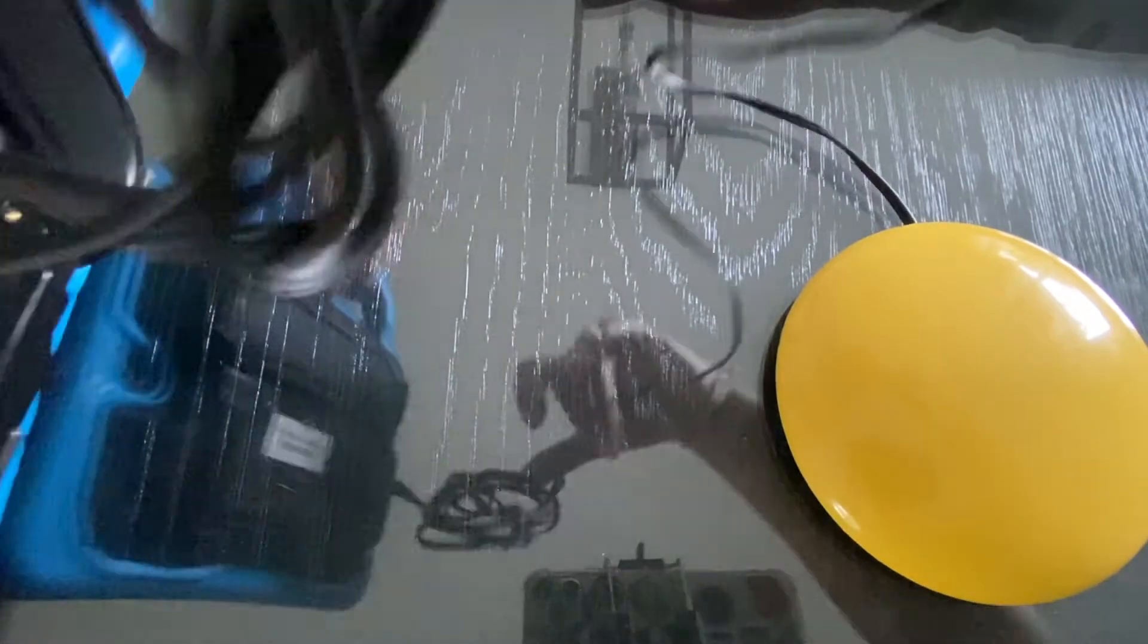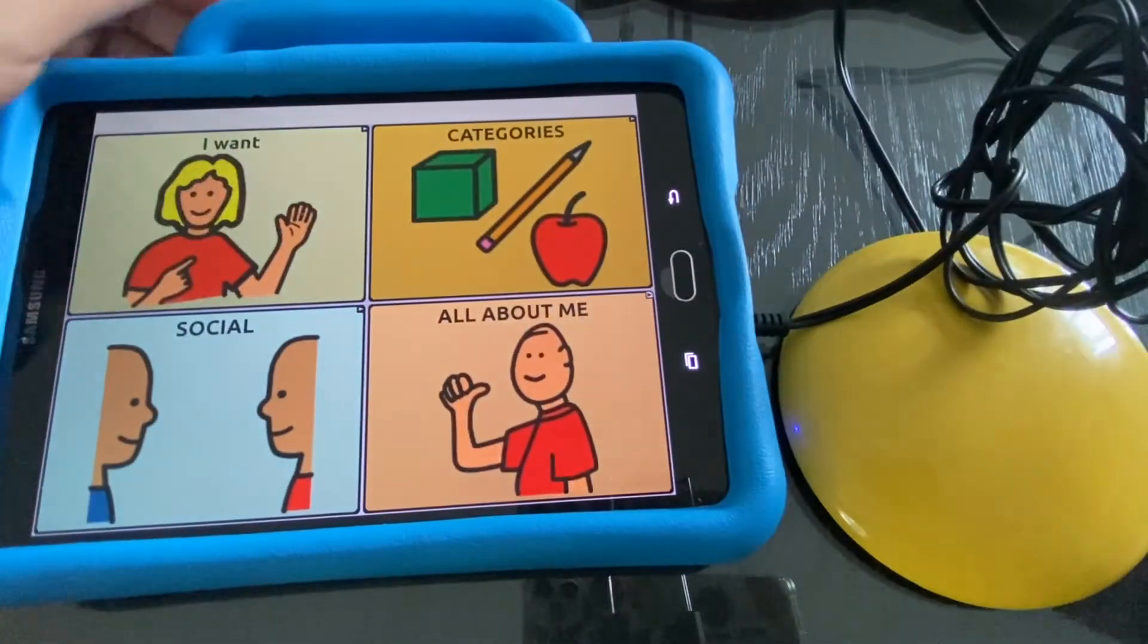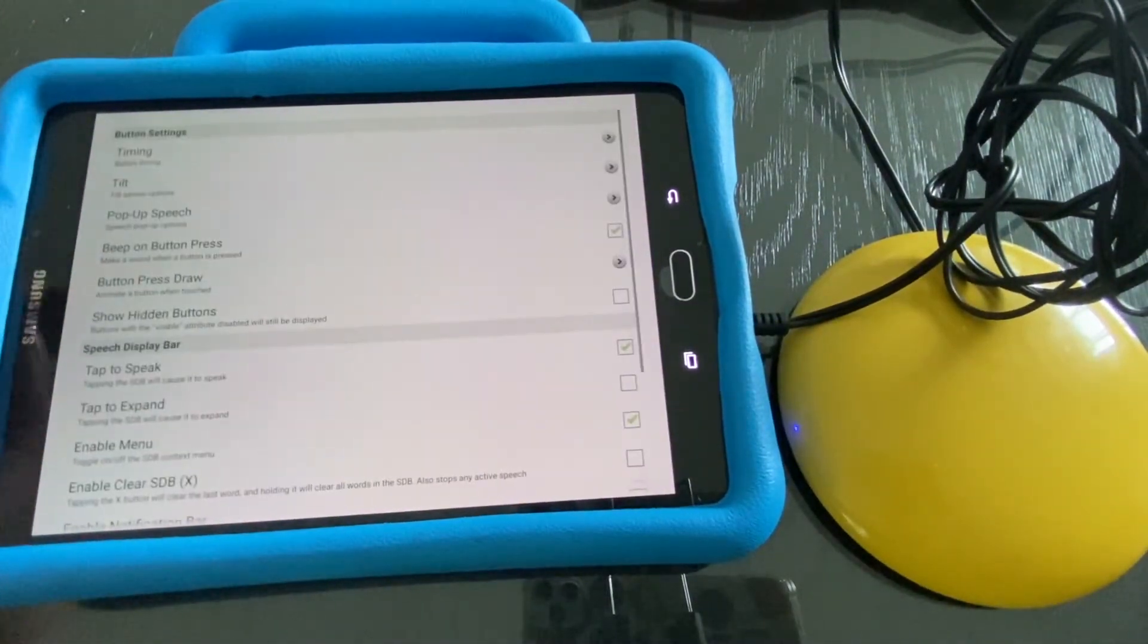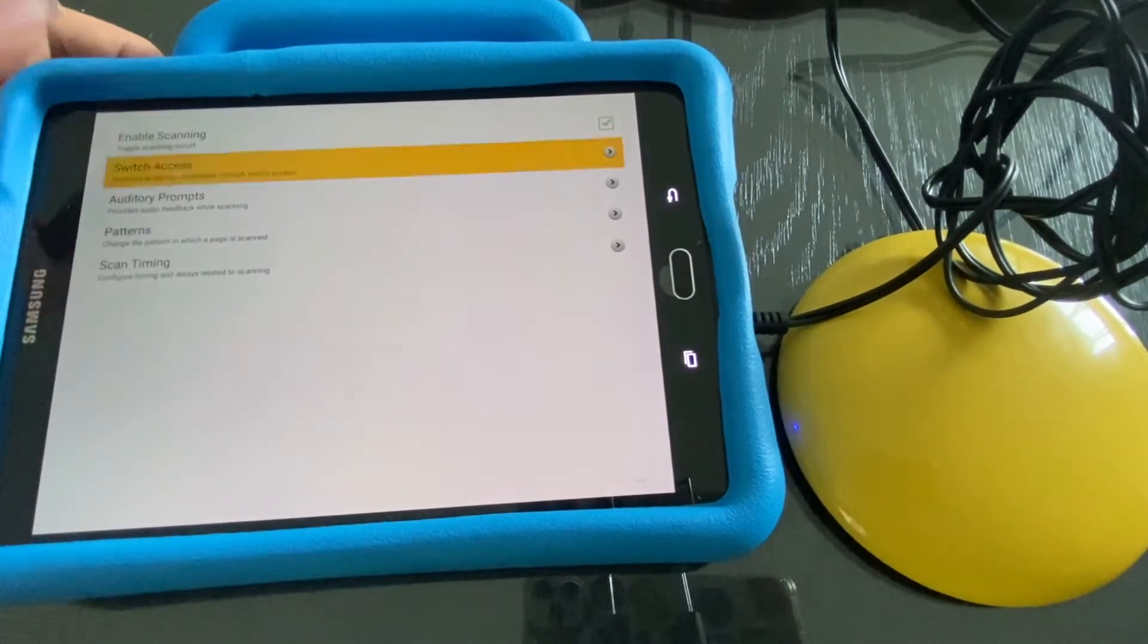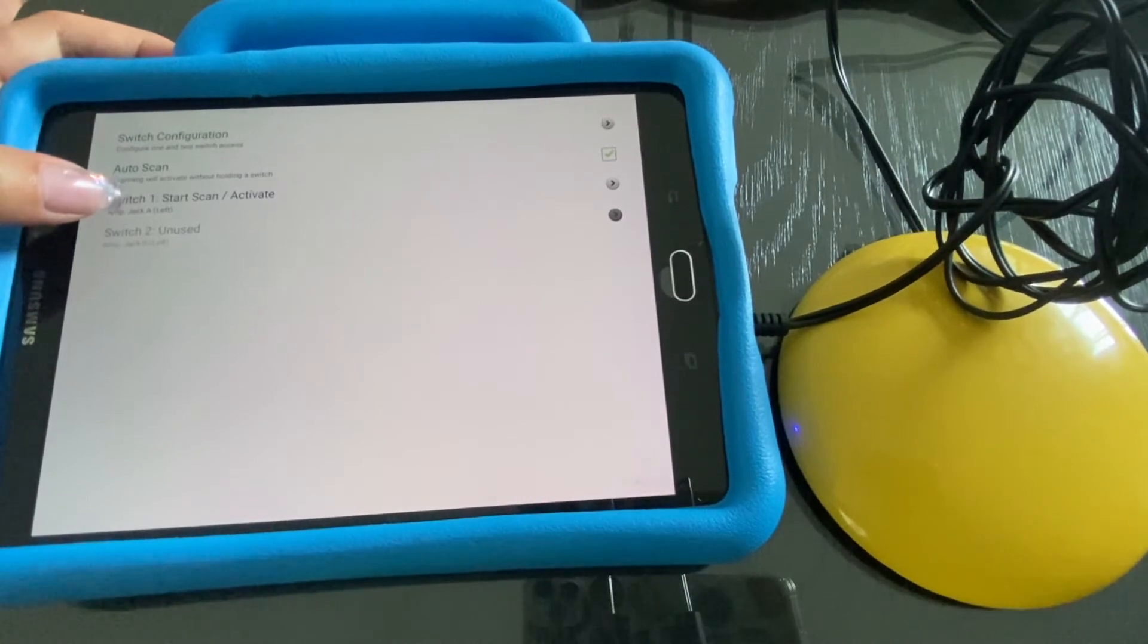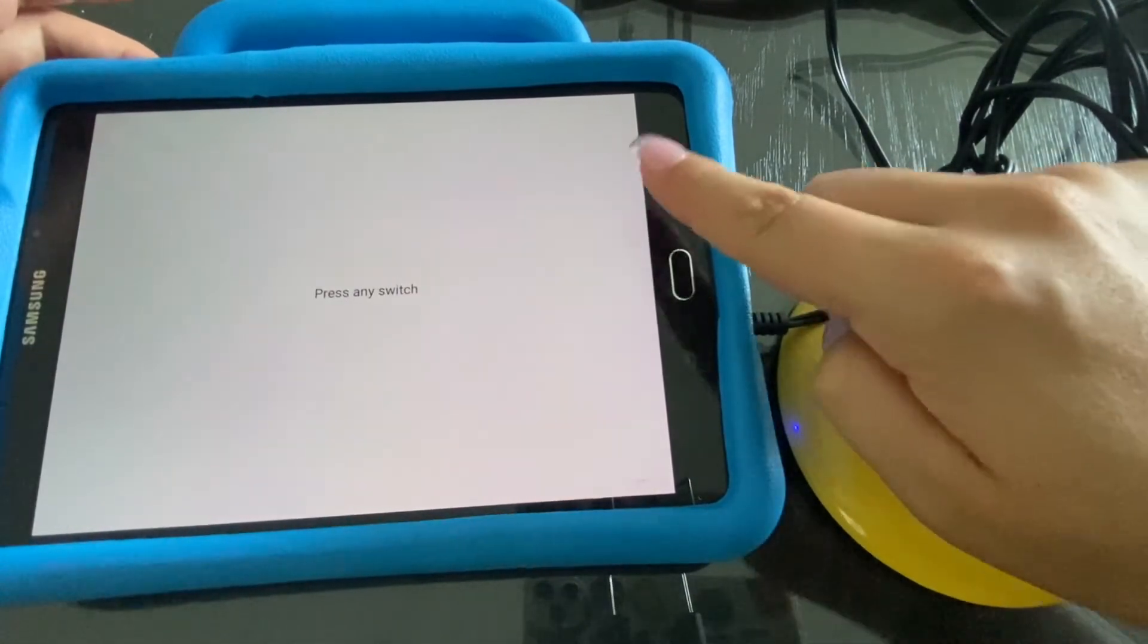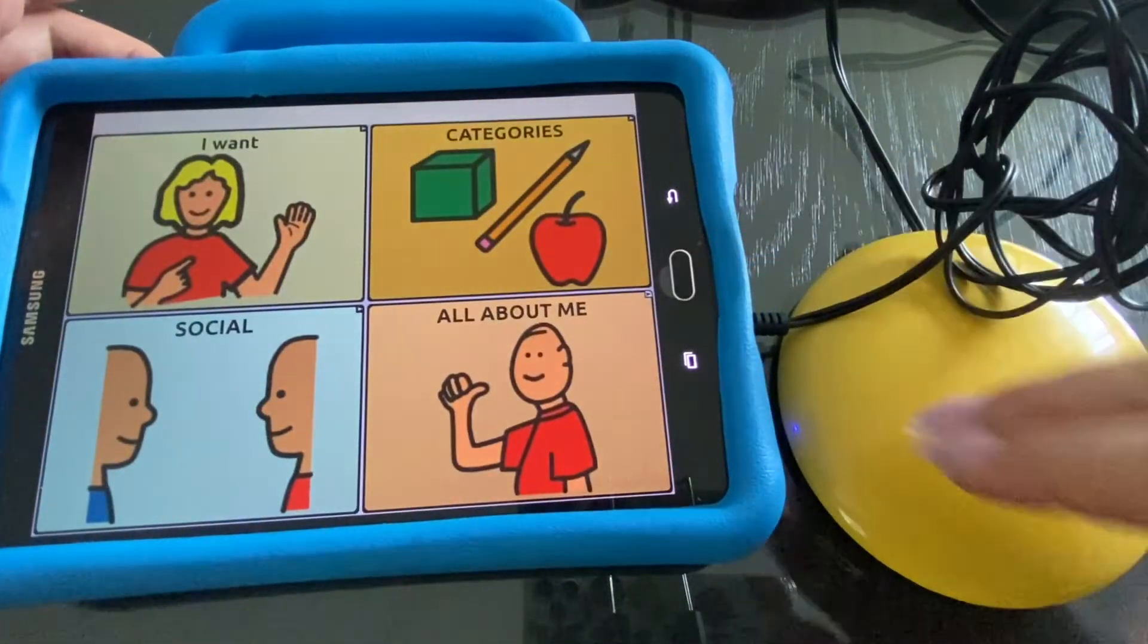Another setting you might want to make sure that you have looked at is the actual buttons. So let's go back into scanning. You want to make sure that you selected one button and you're ready to go.